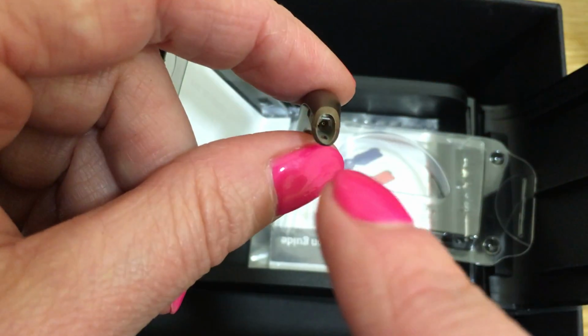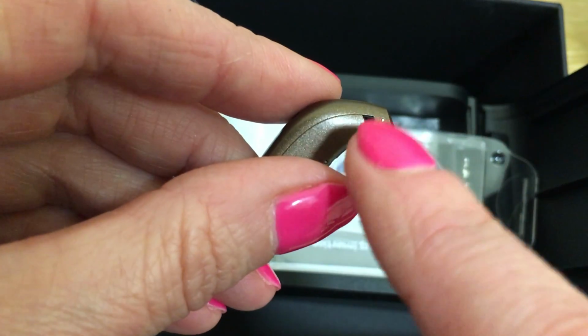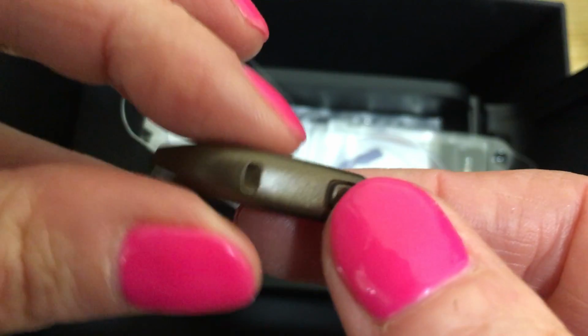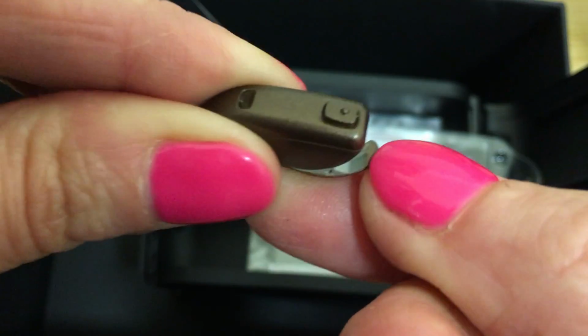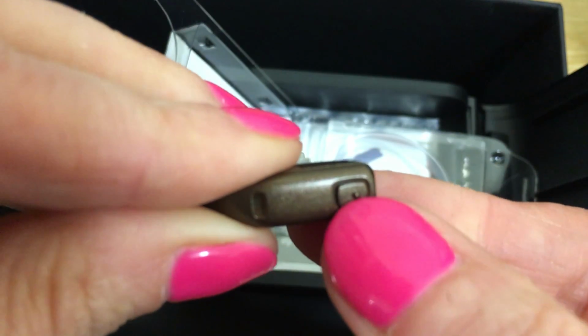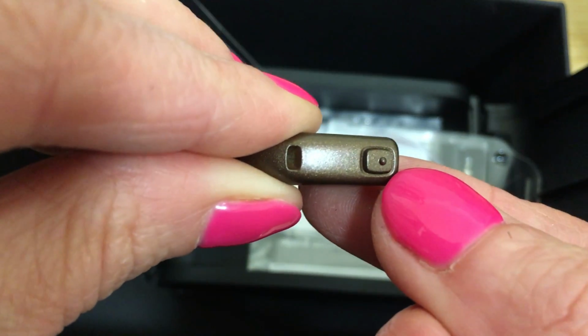This is where we will plug the speaker unit in. That is a microphone port there. Here's the second microphone port over here. This little lip opens the battery drawer, and this button is used to control the volume and any additional programs.